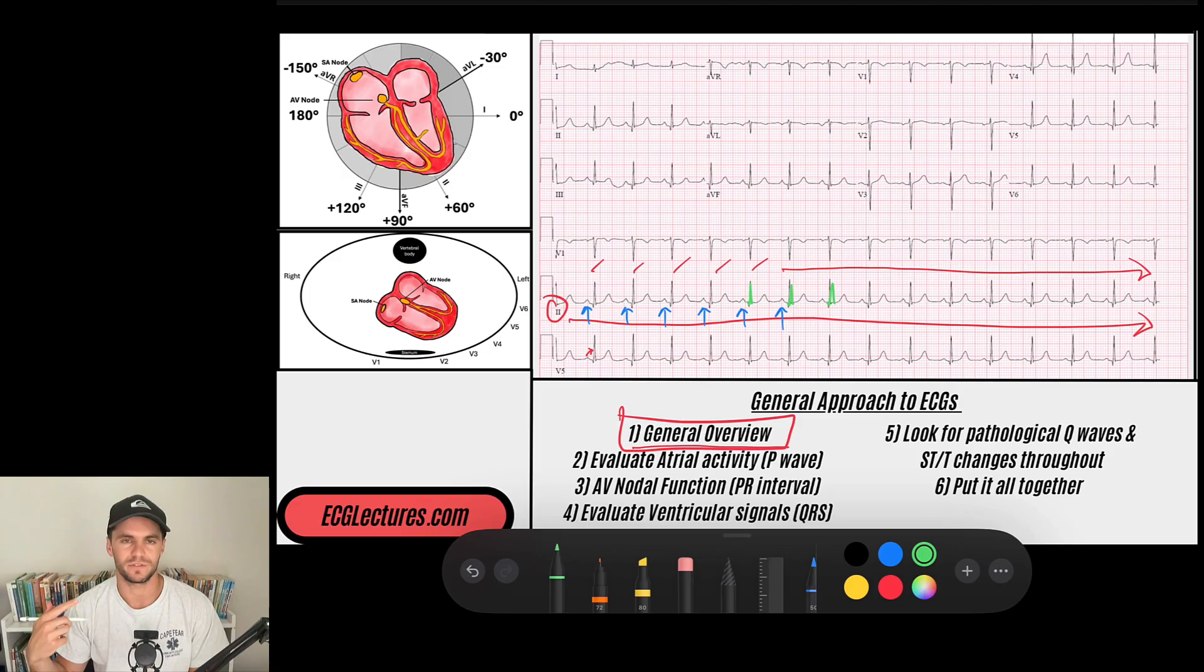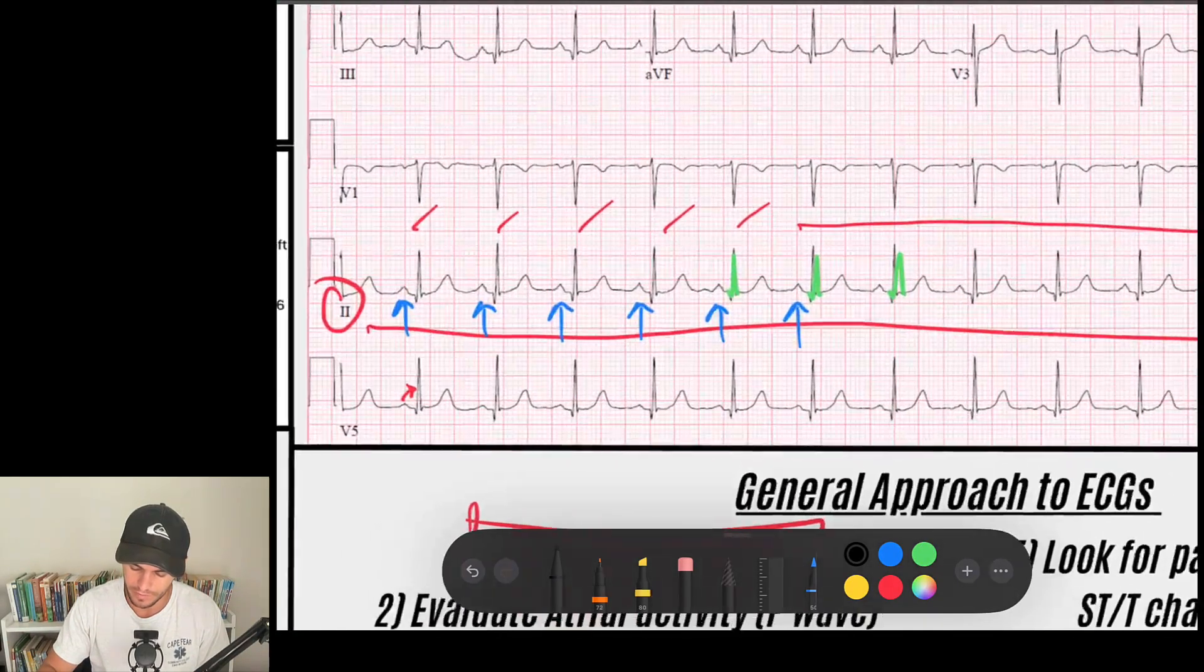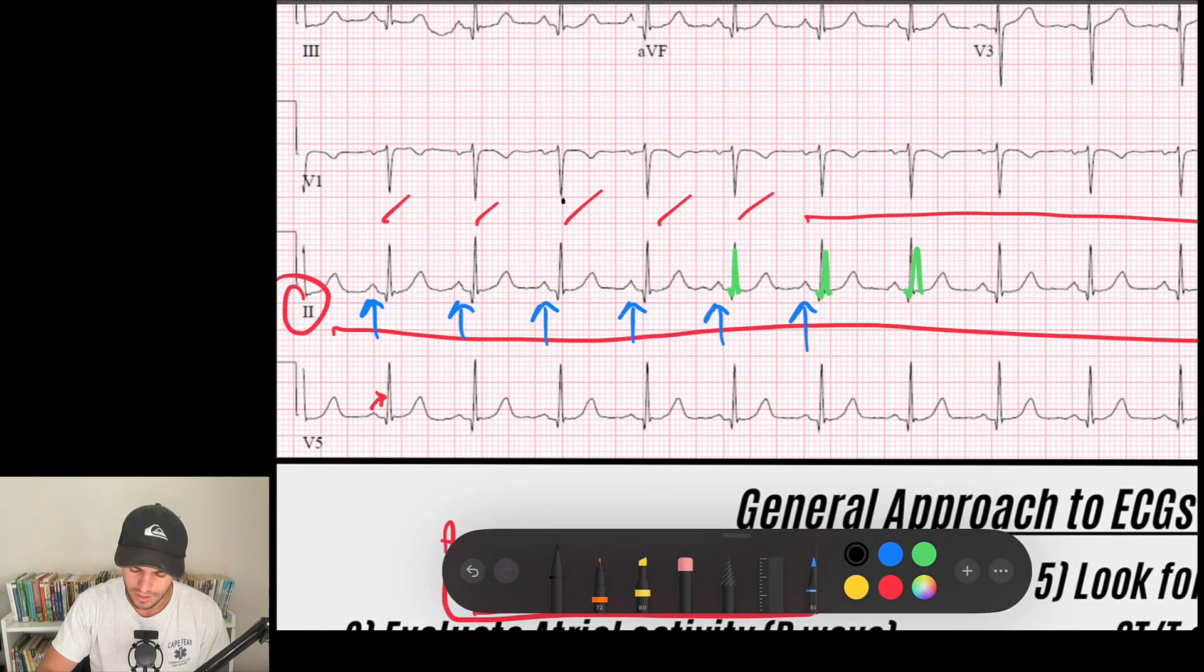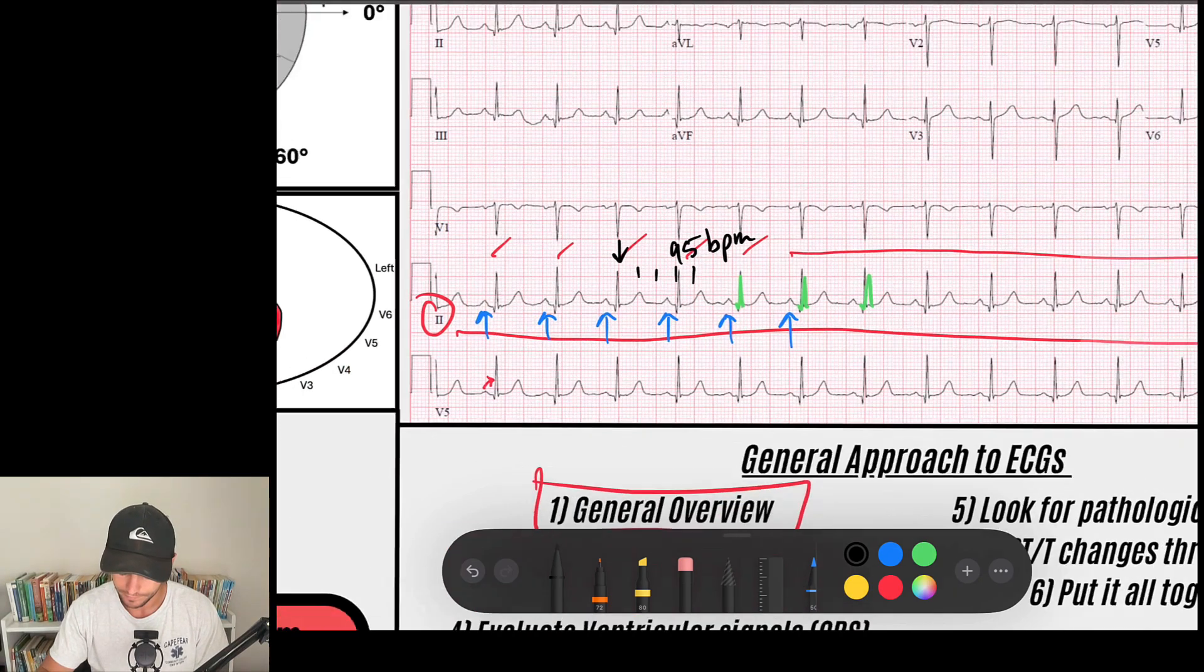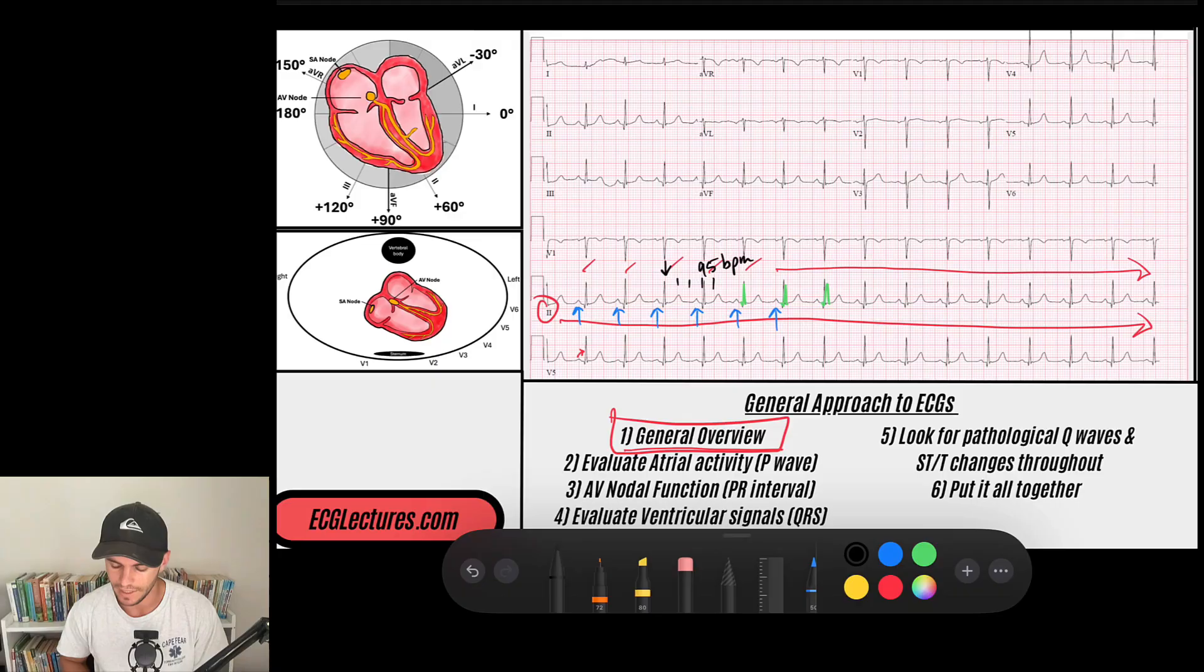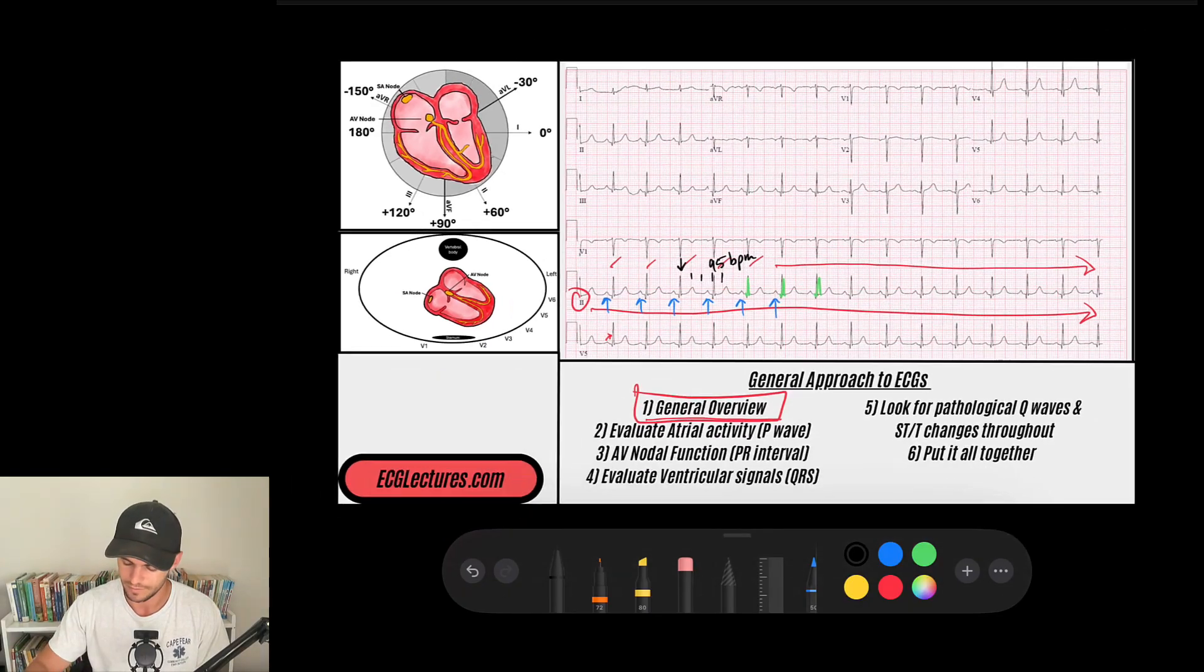That's my general overview. I'm looking for pauses, I'm looking for the rate, I'm looking for all sorts of what I would say are themes of the rhythm. So when we look at the rate of this rhythm, I find a QRS that lands on a solid line, maybe this one, and I've got 300, 150, 100, 75. So this is maybe, I don't know, we'll call it about 95 beats per minute. Let's jump into our next part.